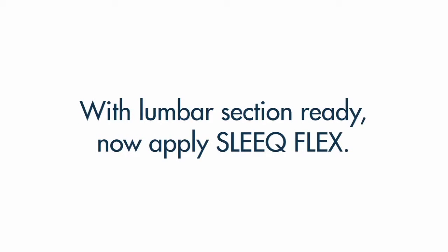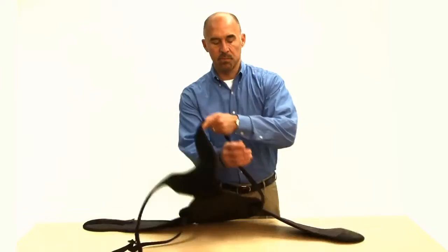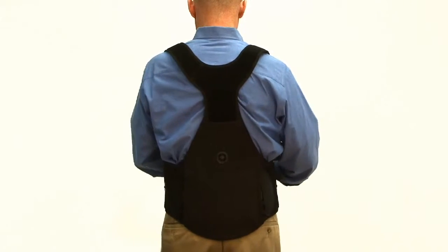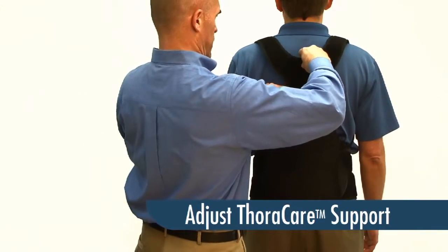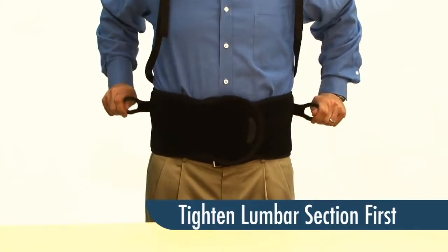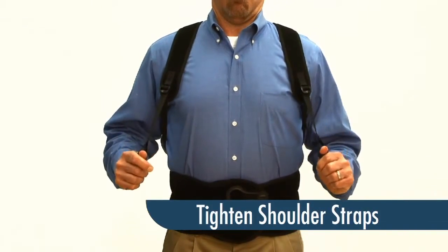After adjusting the lumbar section, we can now apply Sleek Flex. Loosen both shoulder straps and place your arms through the straps like putting on a backpack. Now wrap your Sleek, making sure that it's snug. The Thoracare support system should be adjusted upward or downward so that the top center of the Thoracare support aligns at the T3 scapular spine level. The Thoracare support may be adjusted upward prior to fitting taller patients. To tighten, pull your ComfoGuide pull tabs and reattach anywhere onto the brace. Standing up straight with shoulders back, tighten the Thoracare shoulder straps much like a backpack.